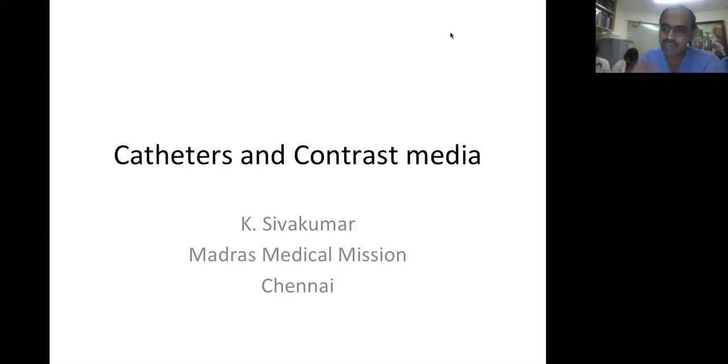Left ventricular opacification is for left ventricular aneurysms, left ventricular thrombus, and left ventricular systolic function. So these are identified. Non-compaction of left ventricular myocardium: you give the myocardial contrast, and you will be able to clearly identify non-compaction. The amount of non-compacted myocardium and the amount of healthy myocardium can be differentiated. A large thrombus in the left ventricle caused by something, for example antiphospholipid antibody syndrome in a small baby: you will be able to identify a filling defect. So myocardial contrast echo and left ventricular opacification are all studies that are possible.